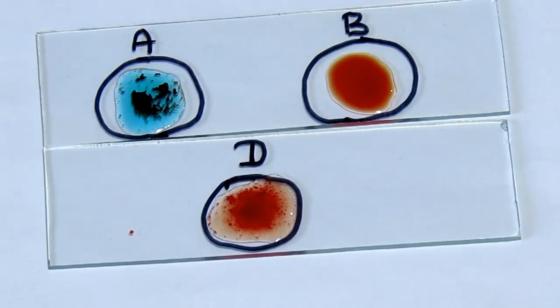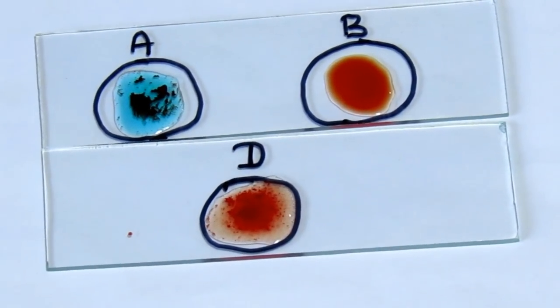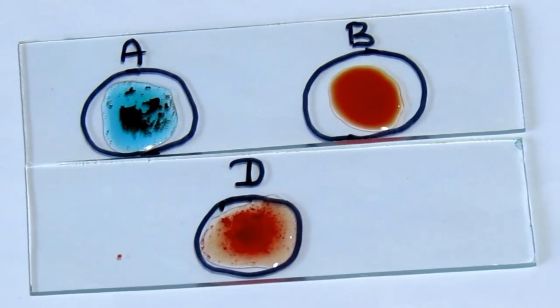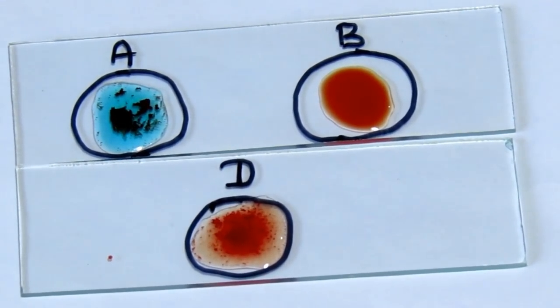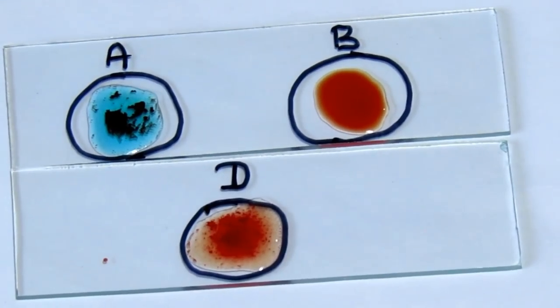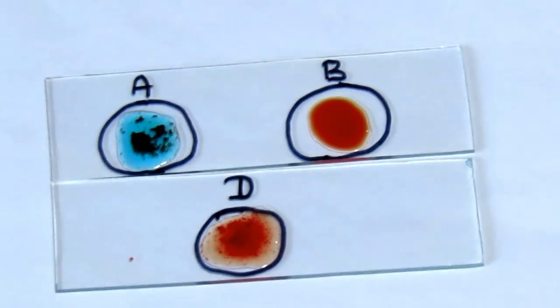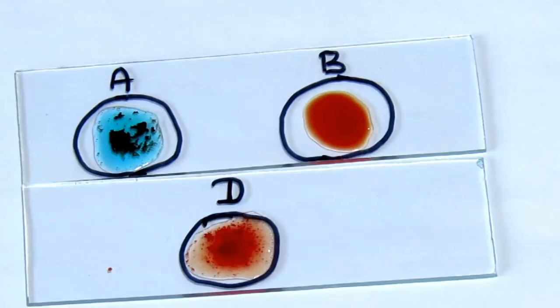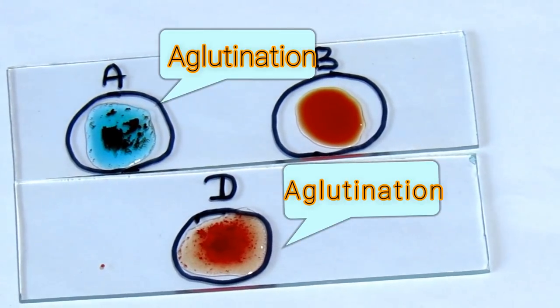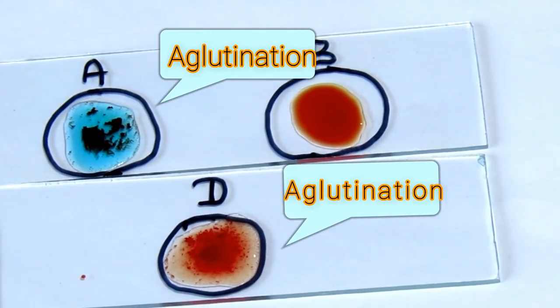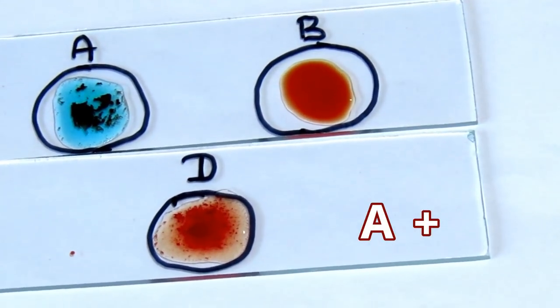See the agglutination. This agglutination indicates blood group. Agglutination at D indicates the positive blood group. As you can see here, the agglutination takes place at A and D, so the blood group is A positive.